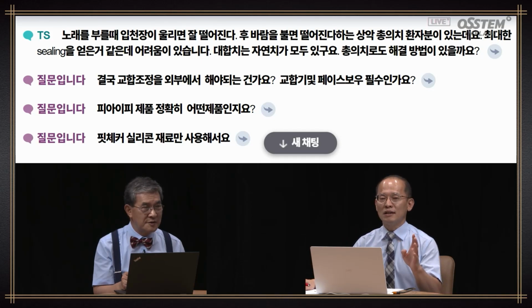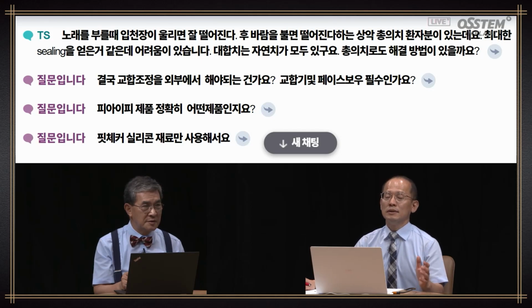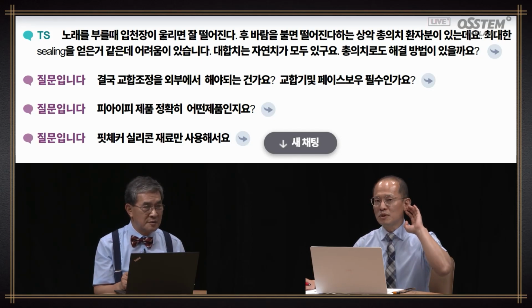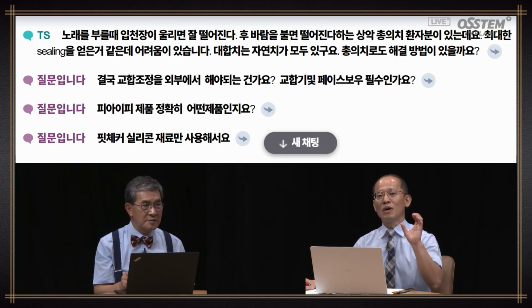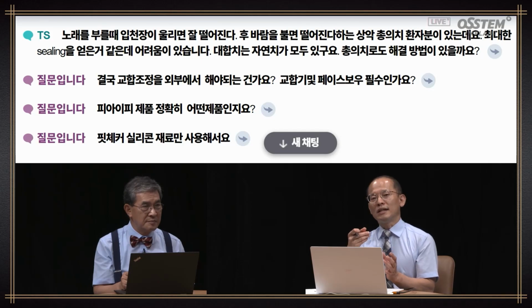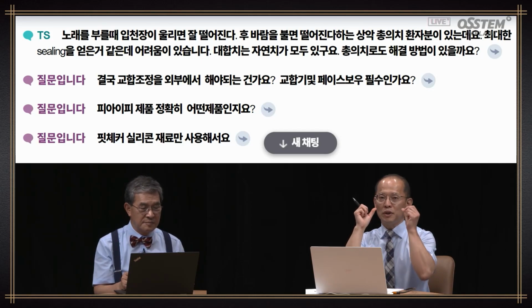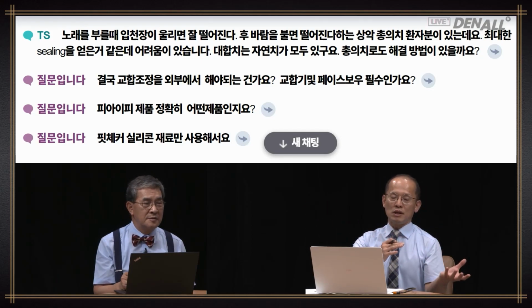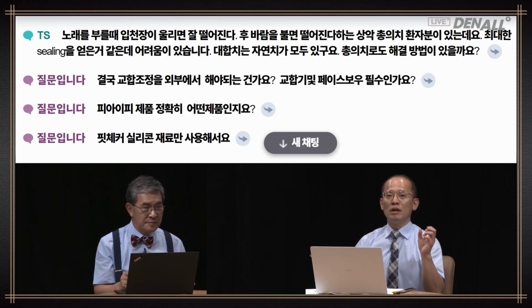And when you take impression, what we sometimes ignore is that when you do border molding on the distal buccal side, on the upper side, there might be a big space. And then in border molding, when we create the working cast, the thickness cannot be copied very well. When you put in the full denture, you might have had thickness in that area, but when you see the final result, it becomes very thin.